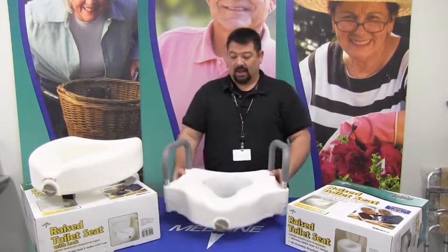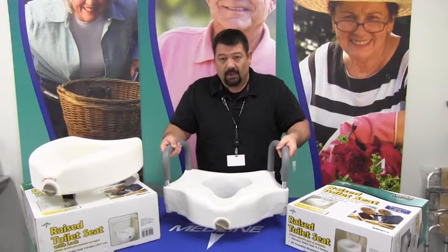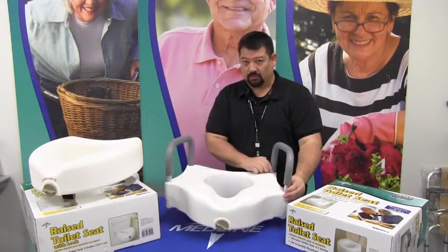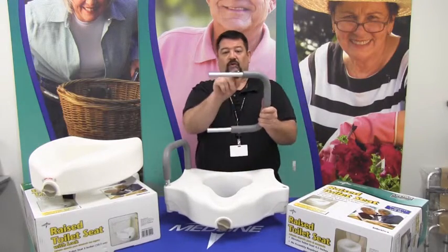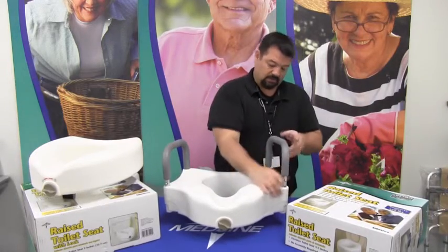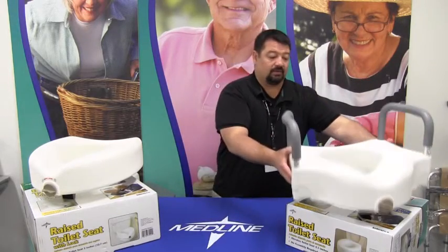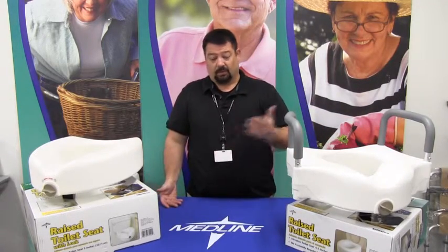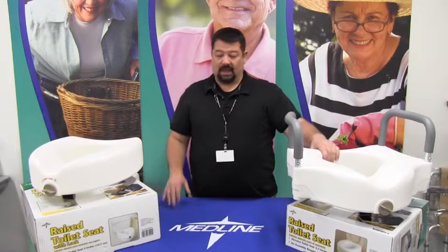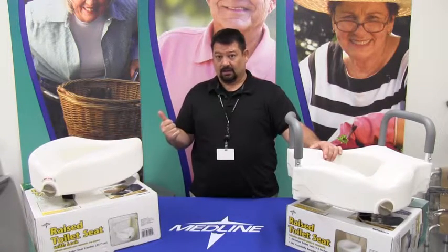Now, besides having a platform to raise, you have a cushioned hand grip to help you get off the commode. Make sure that when you put the arms on, there are two buttons — one pushes the other to lock them into place. Simply push them in and they lock. Once you have these installed, it's just a matter of using them until the patient or person requiring them no longer needs them. Then you simply take it off. As a rule for the locking versions, you are probably going to need to take off the toilet seat and lid to use these.